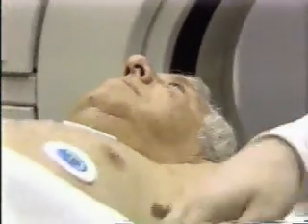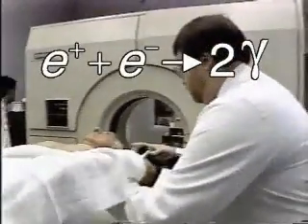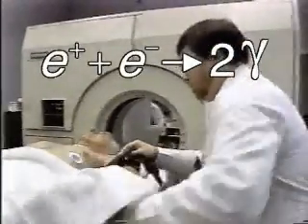In positron emission tomography, radioactive tracers emit positively charged electrons called positrons. These positrons encounter electrons and they annihilate each other to produce two gamma particles.